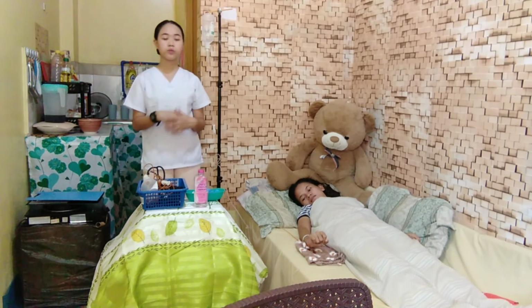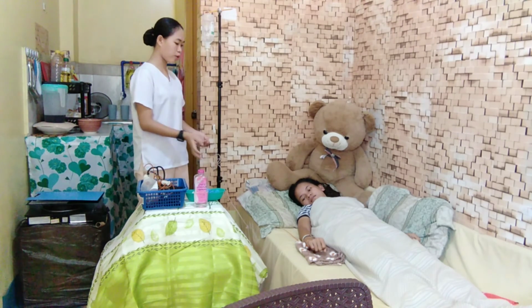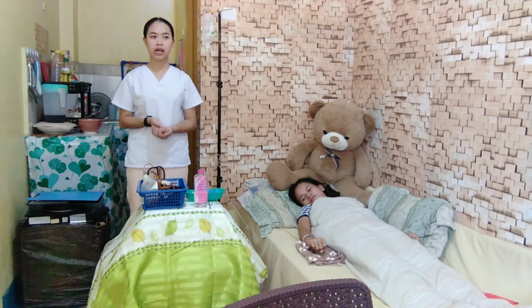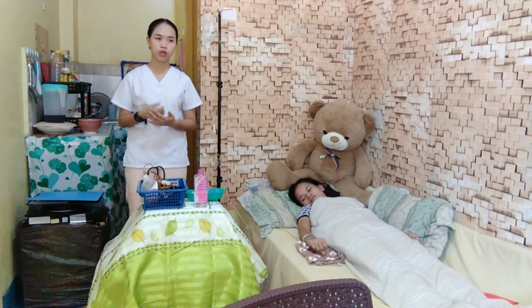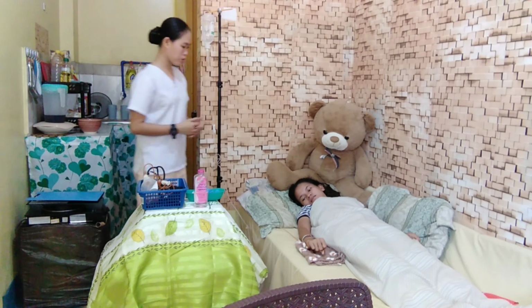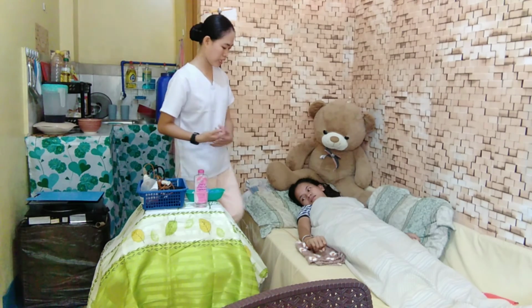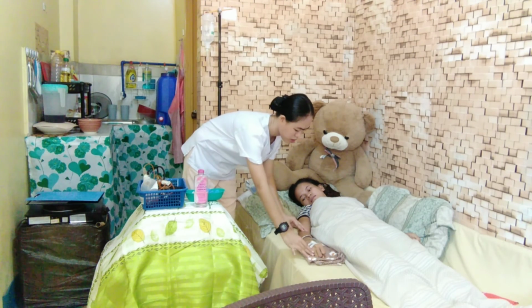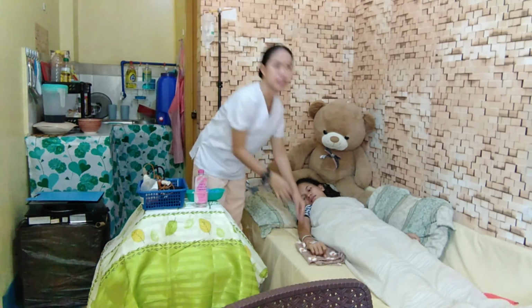After recording, we will observe for any flushing, itching or rash, and instruct the patient to call your attention if he or she feels something unusual. We will observe for flushing, itching, swelling or rash.